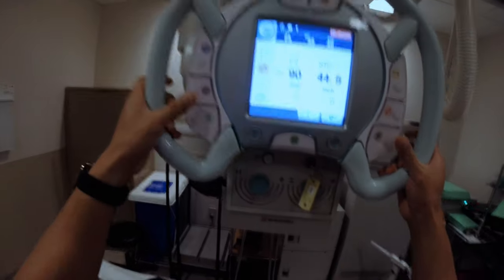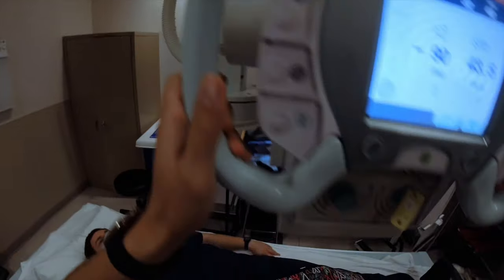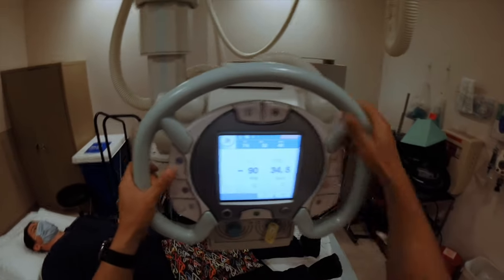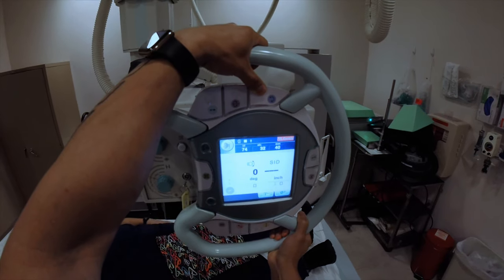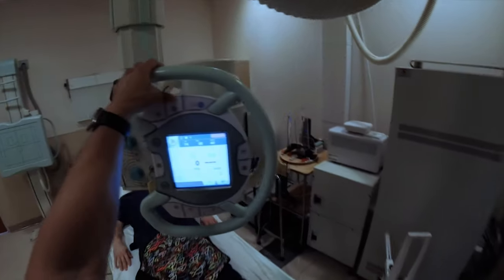So in a moment here, I'm going to bring your good leg up and put your foot in a holder here, okay? You have nothing wrong with your left leg, do you? Your left hip? Okay.